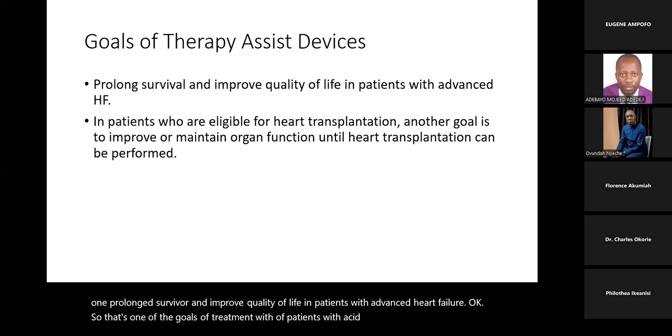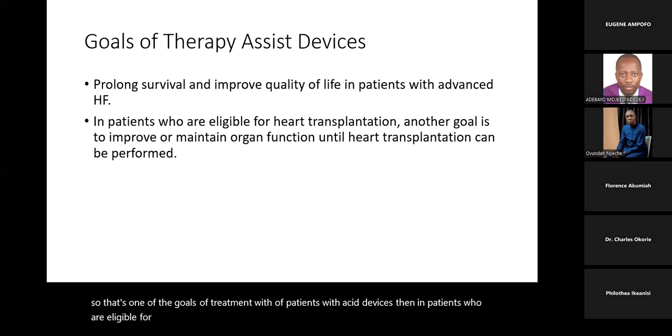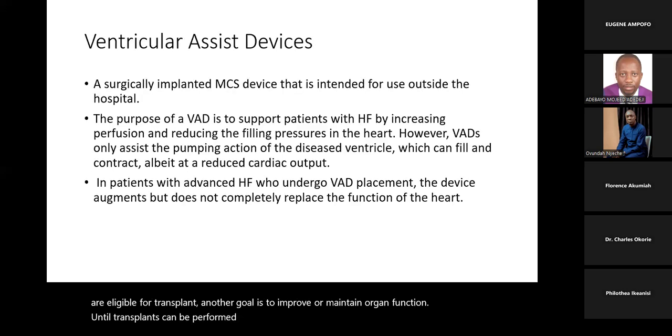Assist devices prolong survival and improve quality of life in patients with advanced heart failure. Okay, so that's one of the goals of treatment. Then, in patients who are eligible for transplant, another goal is to improve or maintain organ function until transplant can be performed. So it's a bridge to transplant.